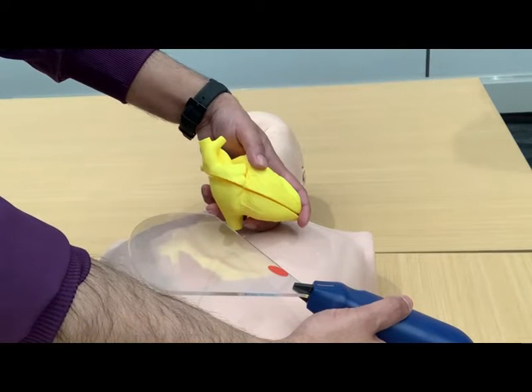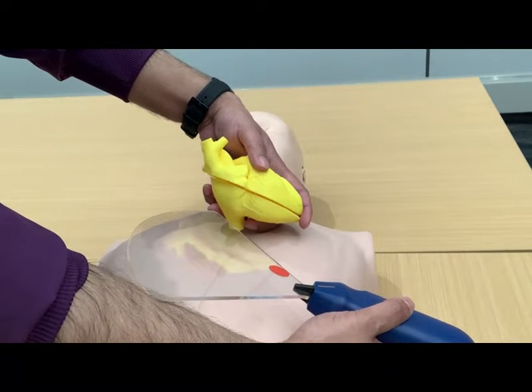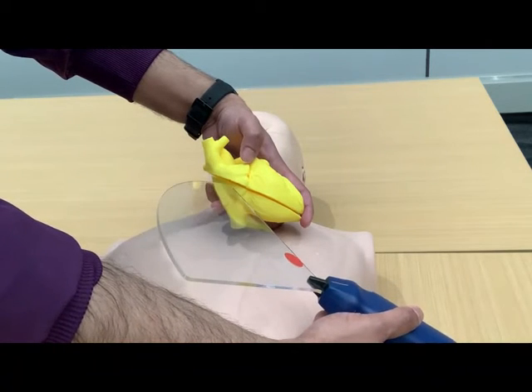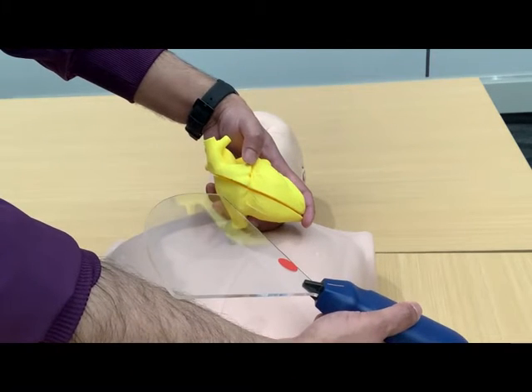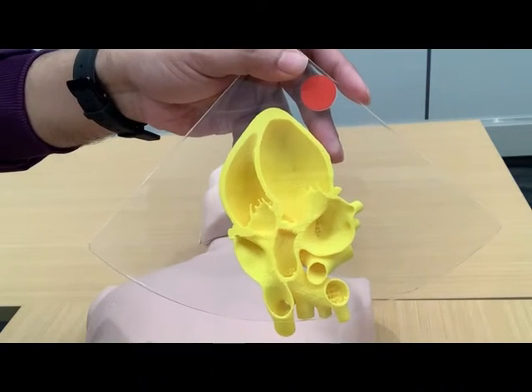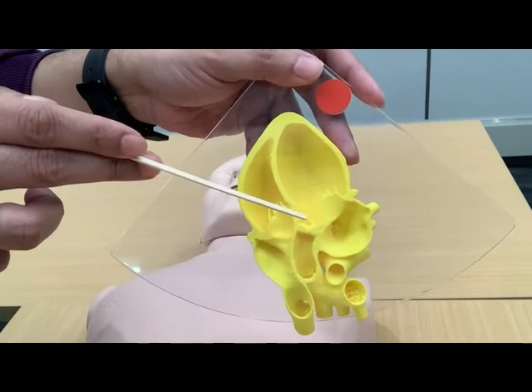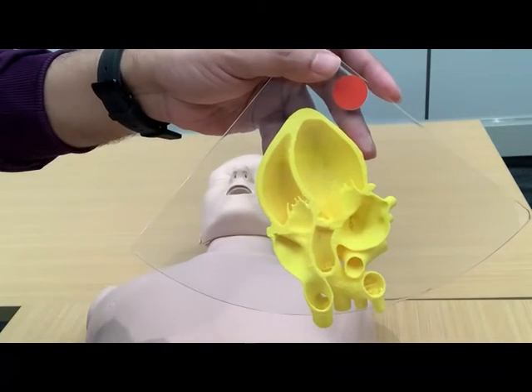From the apical four chamber view, if you want to see the left ventricular outflow tract and the aortic valve to measure stroke volume, you need to see the aorta. The aorta is a little bit anterior from this plane, so you stay in the same intercostal space but tilt the transducer anteriorly towards yourself. You will then get a view very similar to the apical four chamber view — with the left ventricle, left atrium, right ventricle, and right atrium — but in addition you will get a fifth chamber in the middle, which is the left ventricular outflow tract and the aorta, with the aortic valve in between.